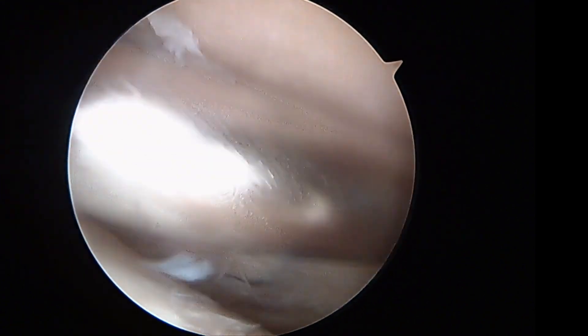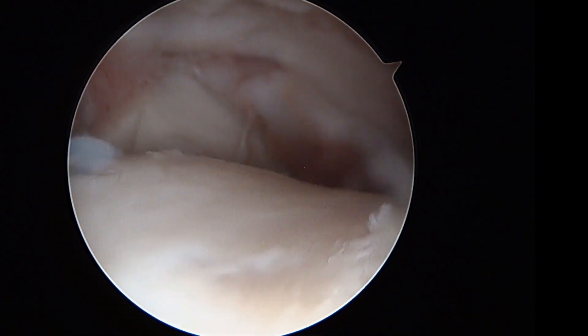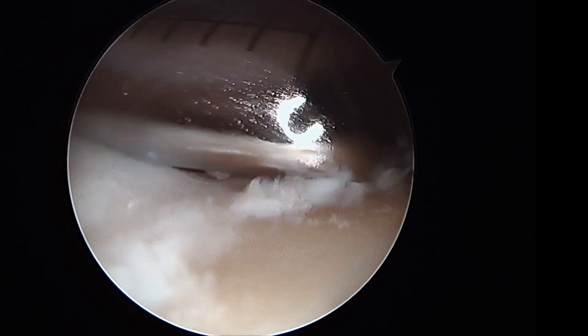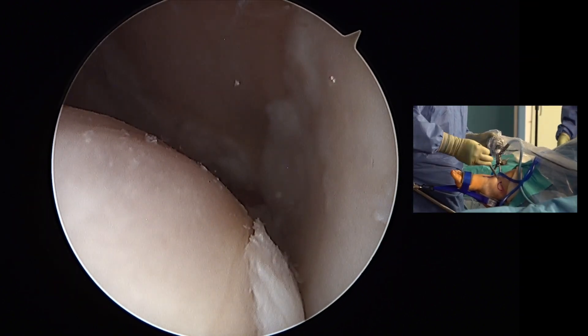Once the initial tibial preparation is complete, attention turns to the talar side. Starting laterally and progressing medially to the area where cartilage was absent.